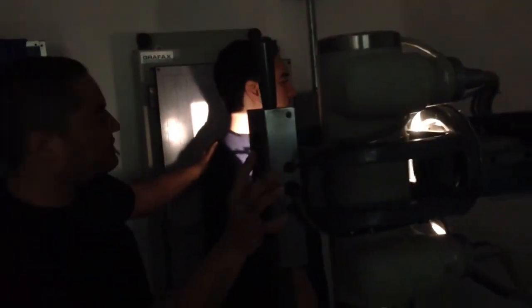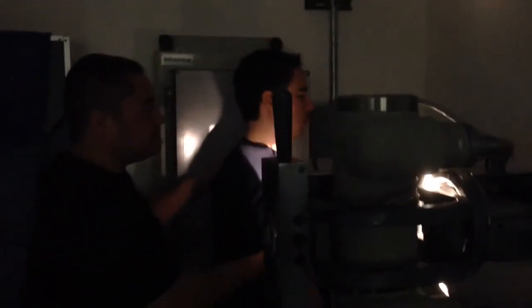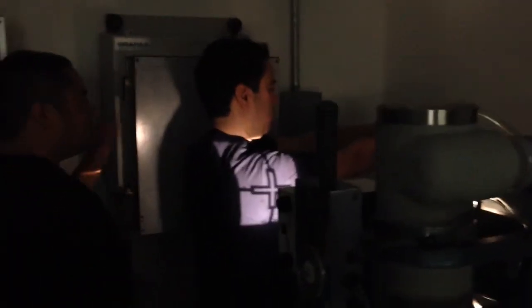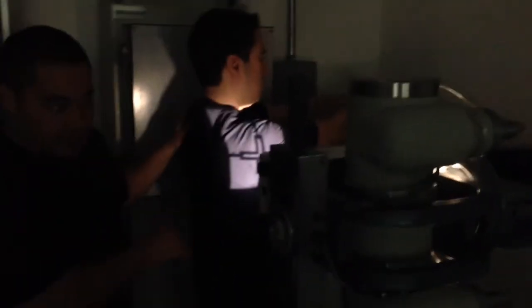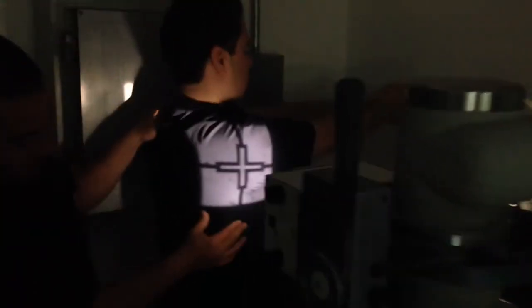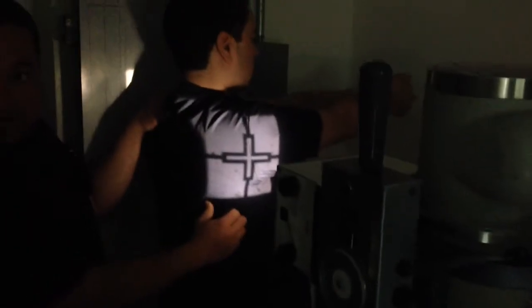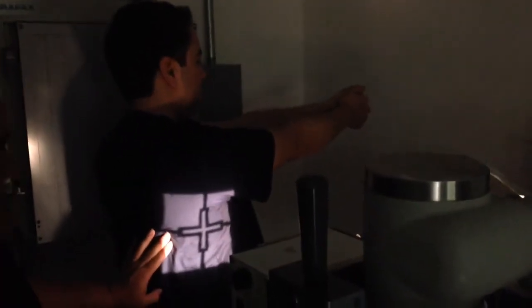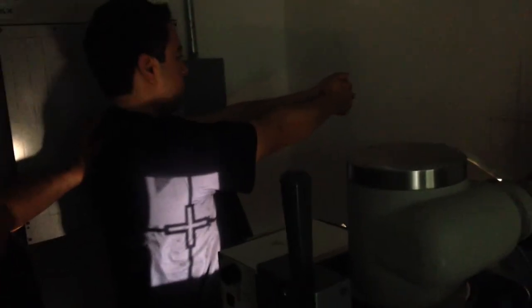Now we're going to do pretty much a lateral chest, right? So again, hold out your arms like you're holding a pole. No, in front of you. I would drop the Bucky, but we're not going to waste time right now. So right here, where his inferior angle is, equivalent to T7, right? T7. We have 14 by 17, so I'll collimate to about 10 by 17.